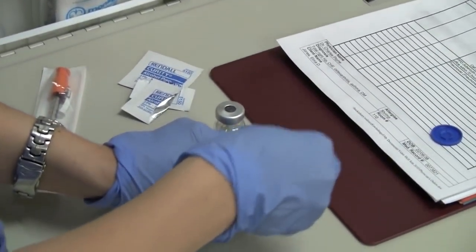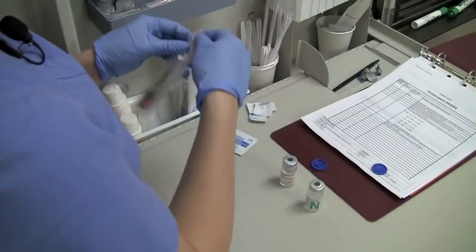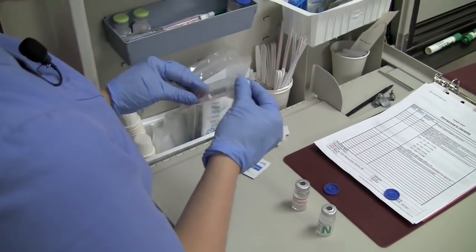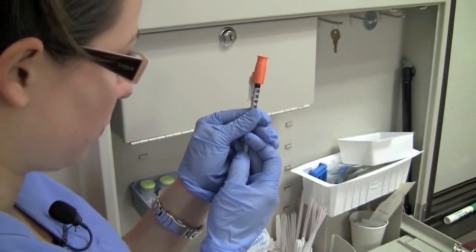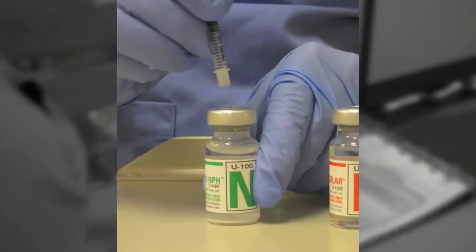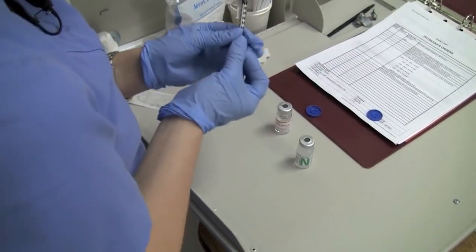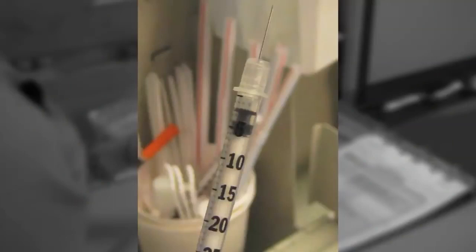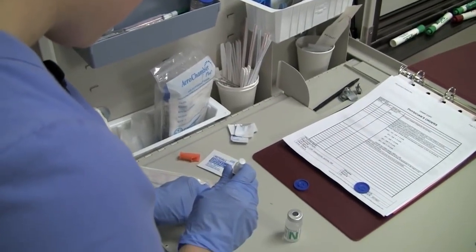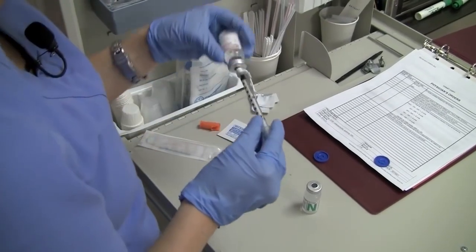Clean the tops of the vials with the antiseptic swab in a circular motion. Using the example of mixing 10 units of regular insulin and 30 units of NPH: with the vial placed on a firm surface, insert the needle into the center of the rubber cap, maintaining sterility. Inject 30 units of air into the NPH vial and withdraw the needle — there should be no insulin in the needle, and the needle should not touch the insulin. Then inject 10 units of air into the regular insulin vial and promptly withdraw 10 units of regular insulin.